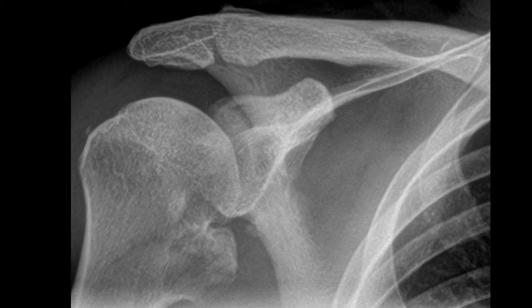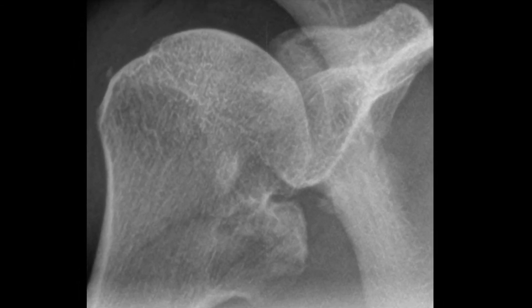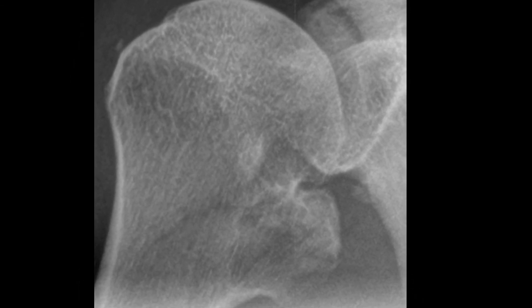The medial proximal humerus is another common location to see osteochondromas. This particular lesion would be classified as pedunculated as opposed to sessile.